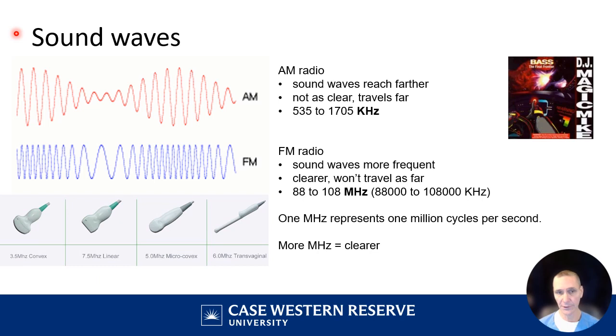So the first thing to know is to get a feel for how sound waves travel. There's lower frequency sound waves and there's higher frequency sound waves. Lower frequency, so that's AM radio or deep bass sounds.